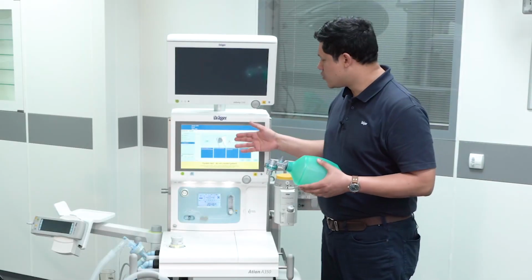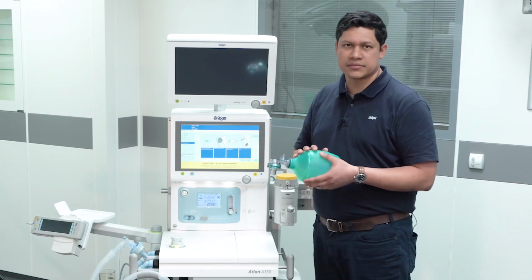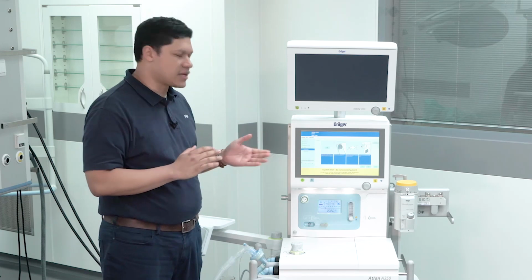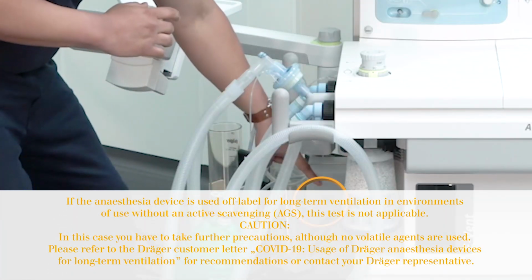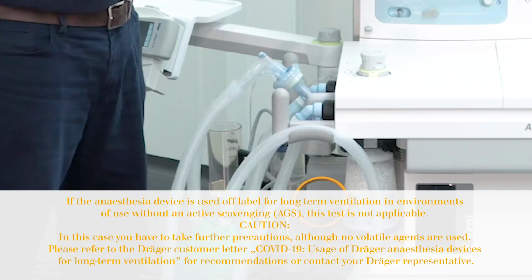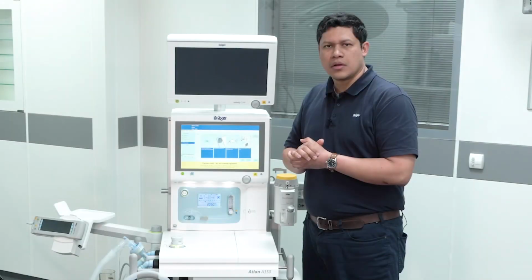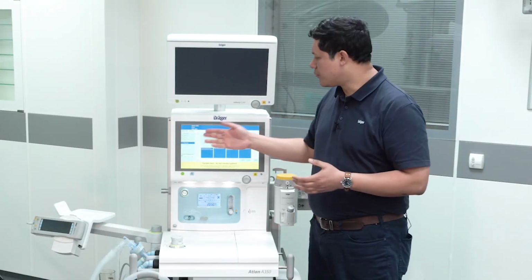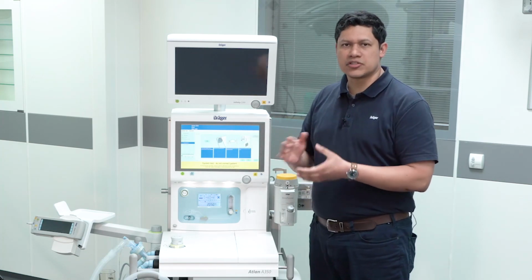Next, you have to make sure that an auxiliary resuscitator is always in the workplace. Then you have to verify the flow of the scavenging system. To do so, you have to check that the flap is correctly positioned between the limits. When you have gone through this group of tests of the different components around the anesthesia device, just press on the check sign.